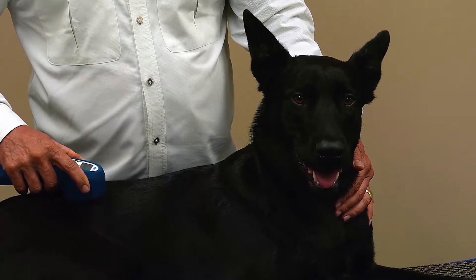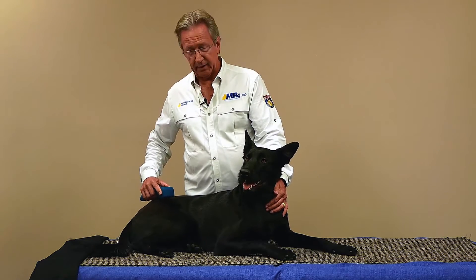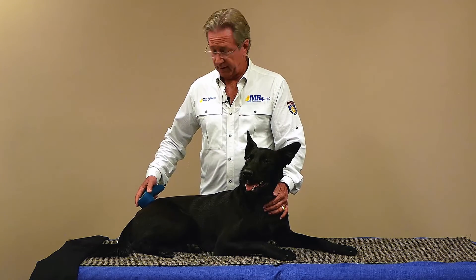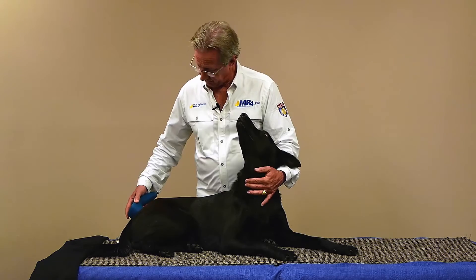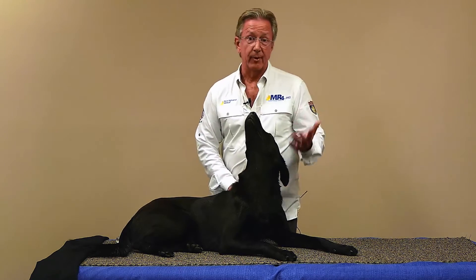It takes at least a millionth of a second for a heat response, so there'll never be an anxiety provocation. They're just really nice and chill. We're getting a nice systemic release of endorphins, and that just feels really good to them — especially your older dog with arthritis. We'll come up here and start down the other side.